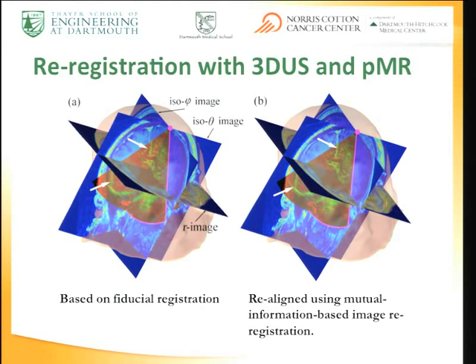And that makes sense, right? You're sampling, if you will, the entire volume rather than having all your fiducial indicators on the surface. So you're doing much better. Why not match up the things that you really want to track and follow during the procedure anyway? Even if there is error, you might as well get those aligned from the start. Even if there is a little bit of movement prior to dural opening, why not get that perfectly aligned and go from there? And so this worked very, very effectively.